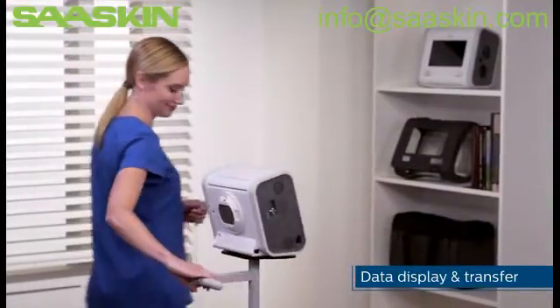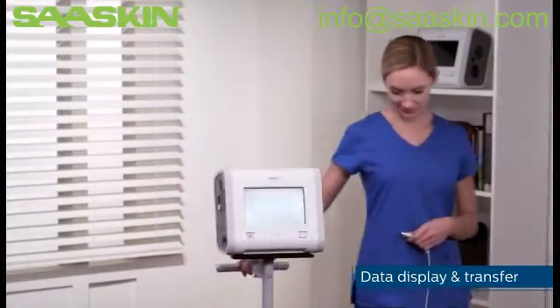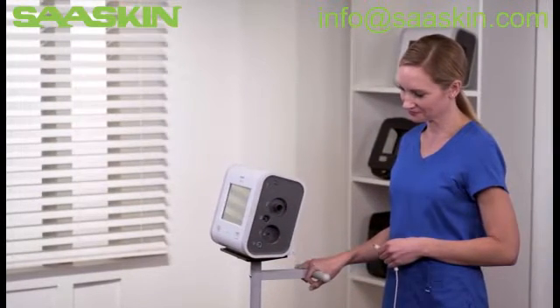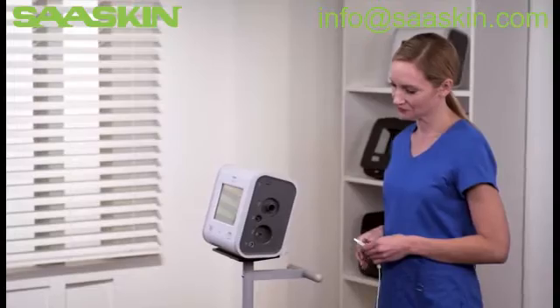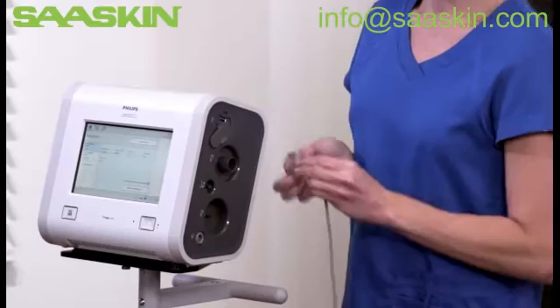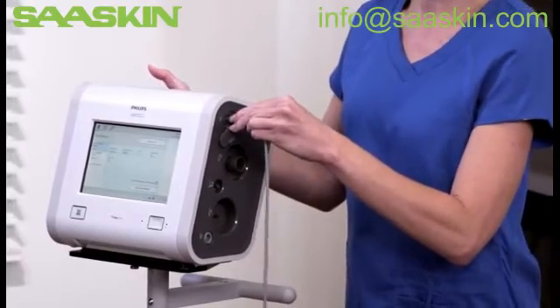Trilogy EVO offers several connection options for displaying and transferring data. First, we'll review the data display accessories: SpO2 and Etco2. Insert the appropriate cable into the USB on either the patient or utility panels.